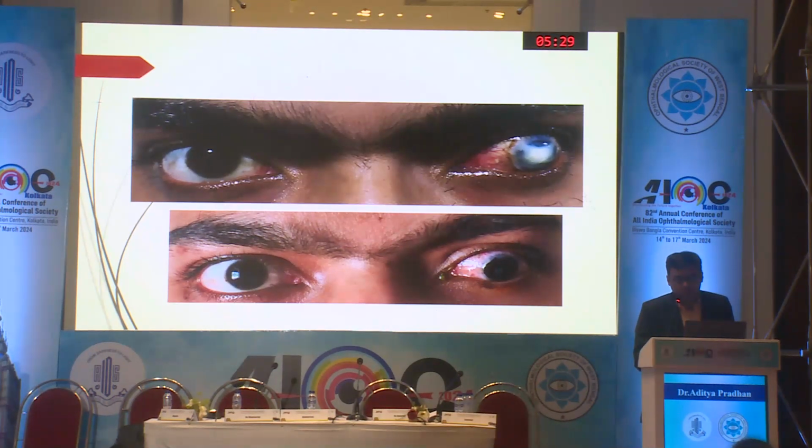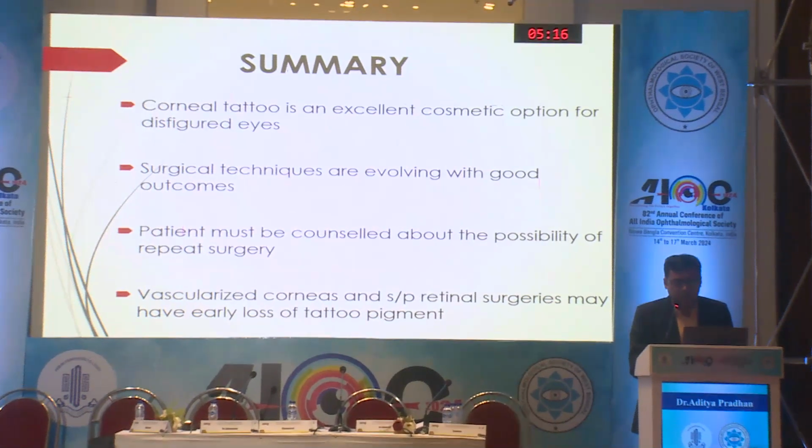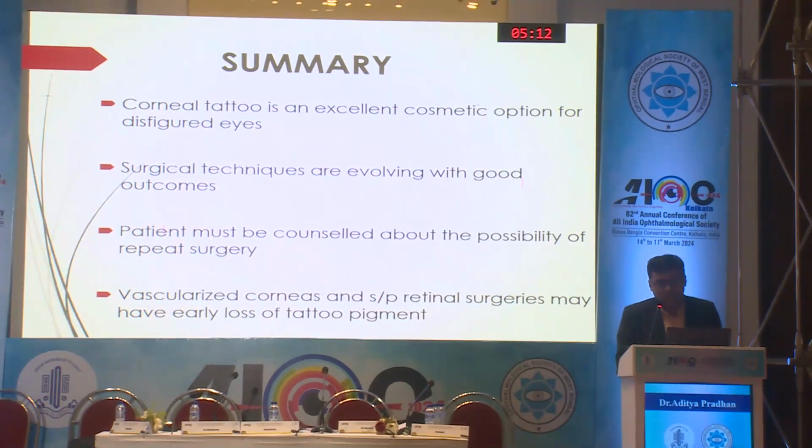This is another photo of a patient who was having this leukomatous scar which is covered by the pigment. So basically tattooing is an excellent cosmetic option for disfigured eyes. We are evolving with better and newer techniques every day, but like any other surgery, a lot of repeated counseling is required both for the patient and the attender of the patient.